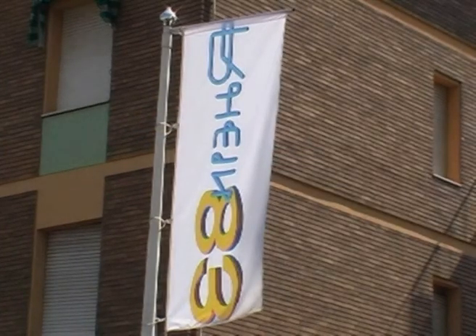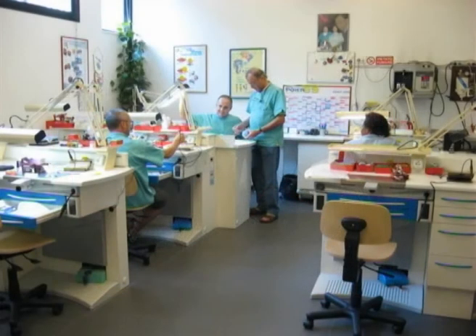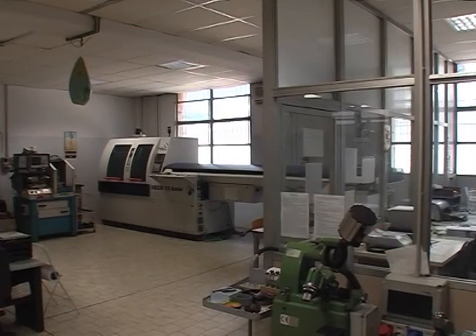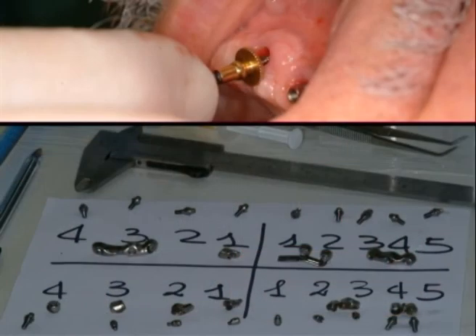Exceptionally for this prosthetic project, Rhein83 has provided its own educational laboratory to realize them for the dentist, who couldn't use his regular laboratory because they were unable to deal with this kind of work. Rhein83's operative micromechanics department also provided essential tools to identify all implants' origin and shapes and measure the diameters and threads.